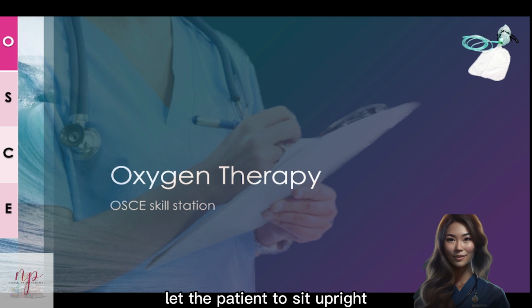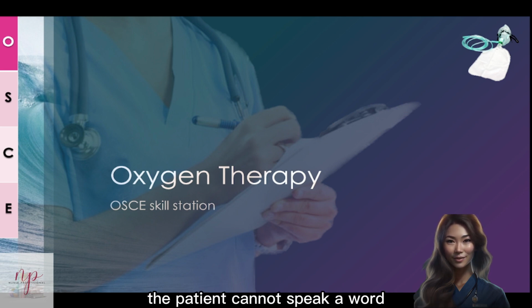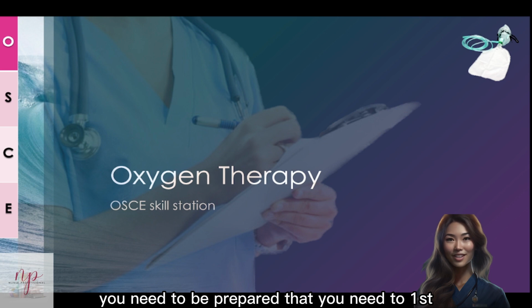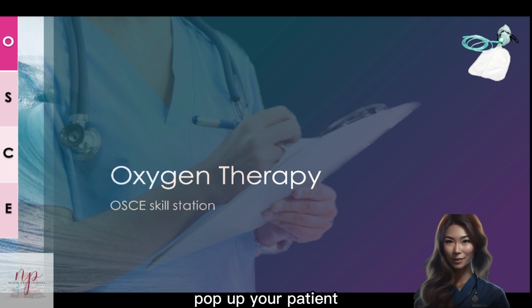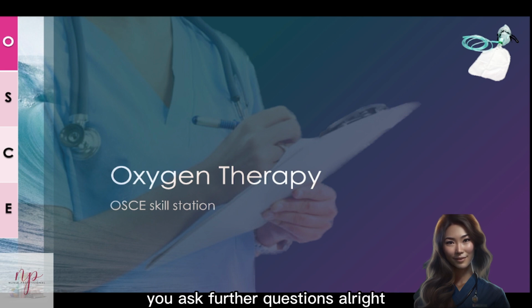Let the patient sit upright. You may need to do this as soon as possible. You may need to do this before you check the identity. If the patients cannot speak a word, you cannot check the identity. So therefore, you need to be prepared that you need to first pop up your patient, and then when your patients feel better, you ask further questions.